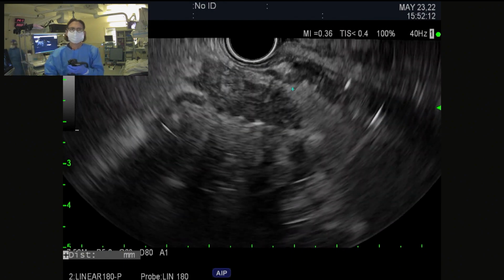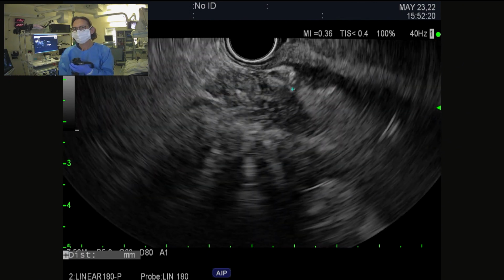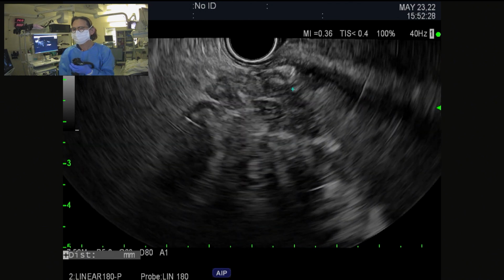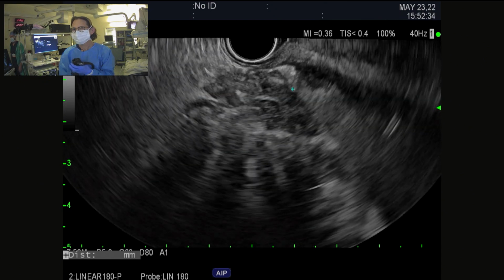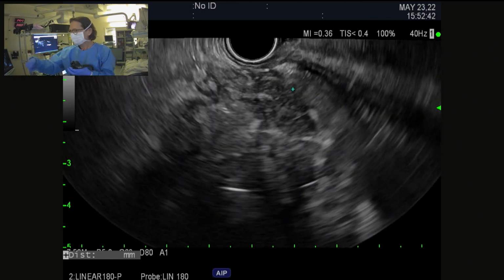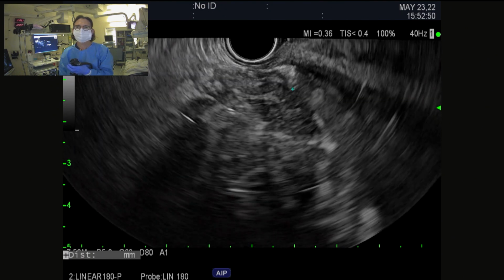Ken, we have a question from Adam. Yeah, Ken, it's Adam. We just tackled a case just like this. Your lower quadrant stent, is it retroperitoneal? Is it the pigtail? Has it been in a while? We did exactly the same thing. Our plan was to put the LAMS in and then maybe do a VARDS or put an esophageal stent through the lower quadrant and go both ways. But actually, with one or two debridement sessions through the LAMS, our guys were able to see the pigtail, so we knew we probably didn't need to go farther.